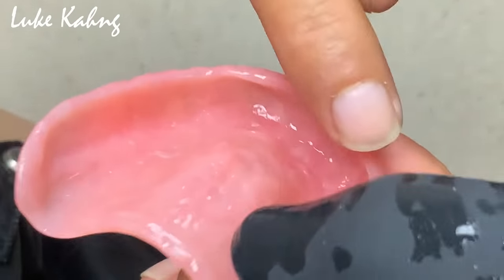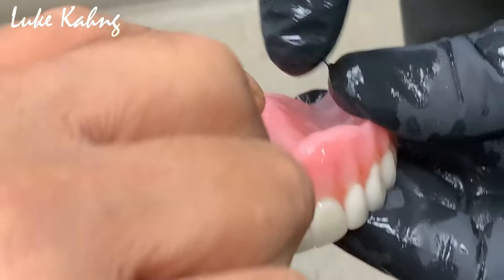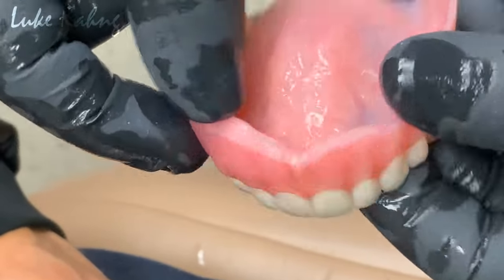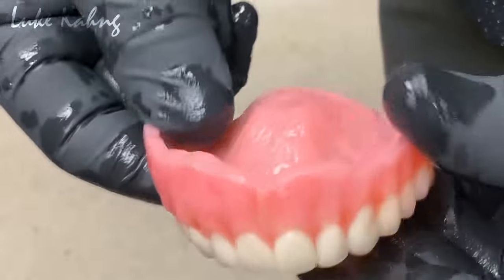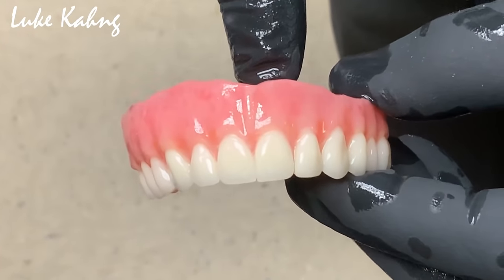Now, aquí arriba. Right there. Este bordito más alto. Yeah. And it gets to the point too where the patient actually starts to let you know exactly where it is. So he's saying this little border on the inside just needs a little fine contouring right in here. And you go through that and you should never have to use any glue, any fixit. If you're using that, it's either time for a reline or time for a new denture.